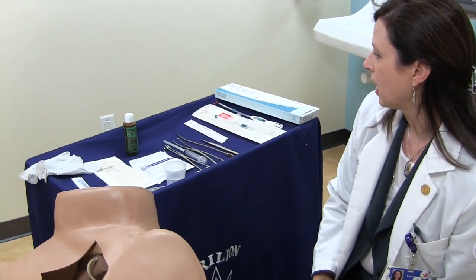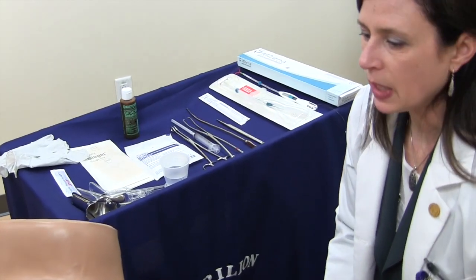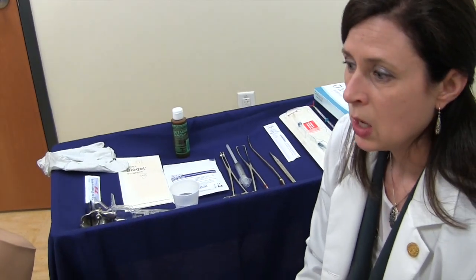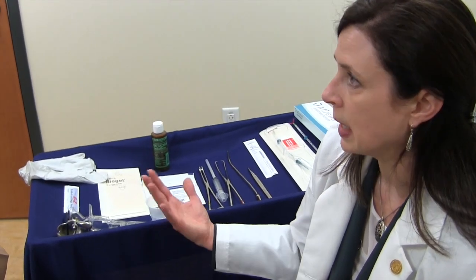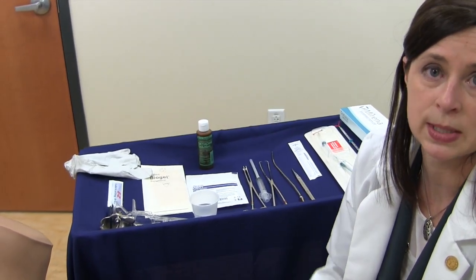Additional things that we have set up within our teaching room: we have other equipment for a typical IUD insertion, and if someone does not have a ZOE simulator, there are certainly other models that we have used in the past, including some homemade models demonstrated in our other video. In addition to an exam room such as this, you could certainly do this in a workshop style — whether circular tables or rectangular tables in a U shape — in which one instructor can circulate around and oversee 6, 8, or 10 learners on ZOE simulators or other homemade models.